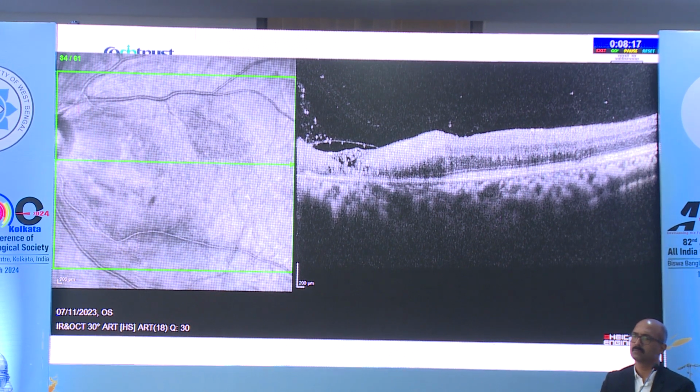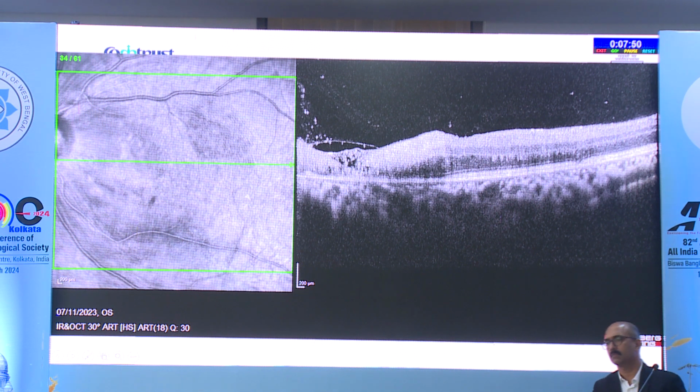If you look at the OCT, you can see that there is an active portion of the lesion, a retinitis lesion. The active portion is a full thickness retinitis, which is casting a shadow behind, and there is a classically described cavernous type of outer layer defect that is very characteristic of CMV retinitis. And here the healing lesions show early atrophic changes. There is a granularity of the inner retina, and disorganization of inner retinal layers setting in, and the retina is subsiding, with the ILM getting detached from it.